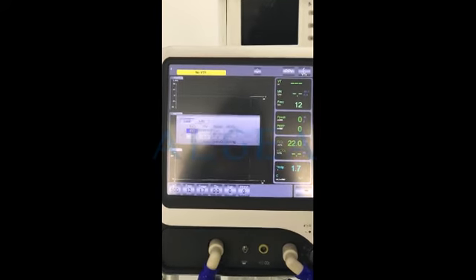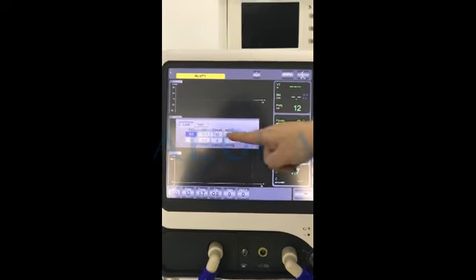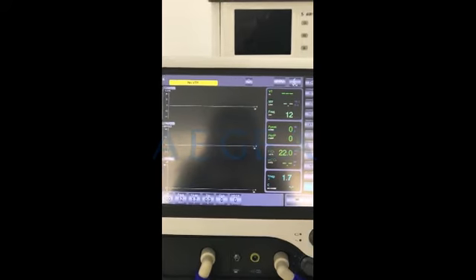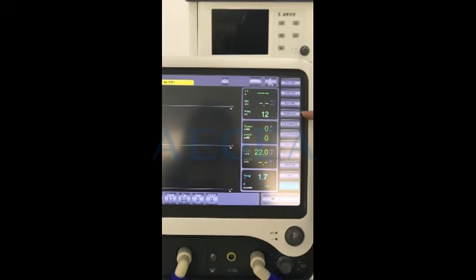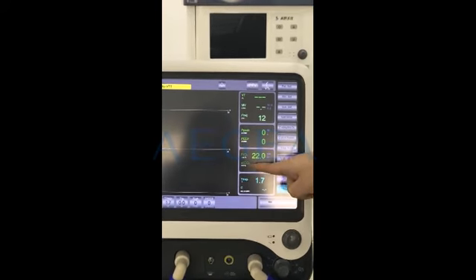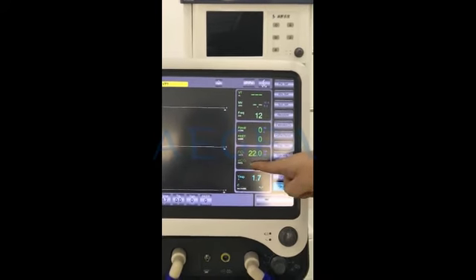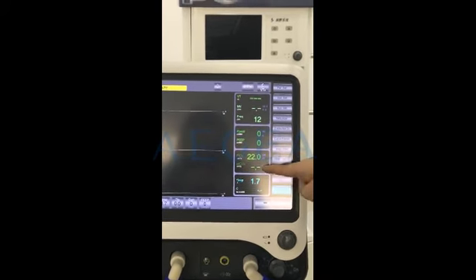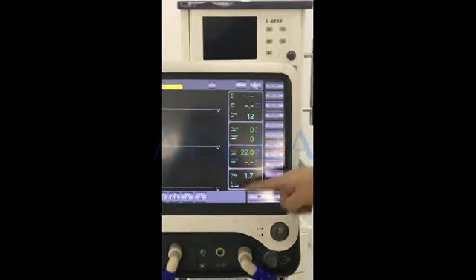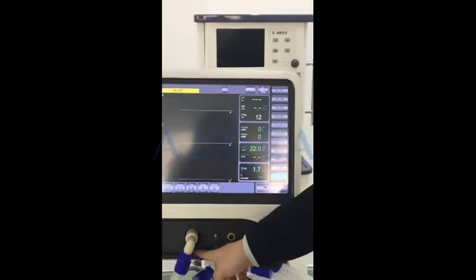Here is the alarming limit setting. We also have the nebulizer function, and we have the ETCO2 module, which can be monitored on the screen directly.